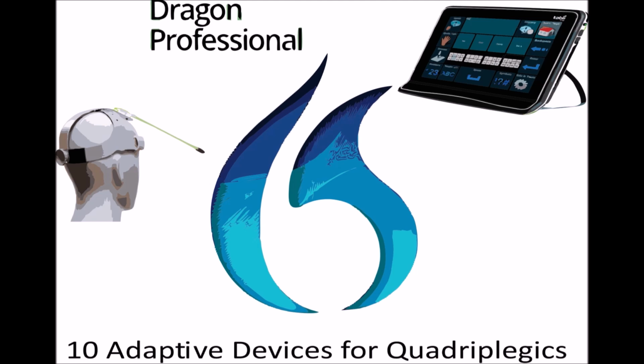It can also increase productivity and efficiency for users who need to input large amounts of text or perform repetitive tasks. However, voice-activated software may not be as accurate as typing or other input methods, and users may need to train the software to recognize their voice and accent. Additionally, background noise, accents, and speech impediments can affect the software's accuracy. Nonetheless, advances in natural language processing and machine learning have improved the accuracy and usability of voice-activated software in recent years.